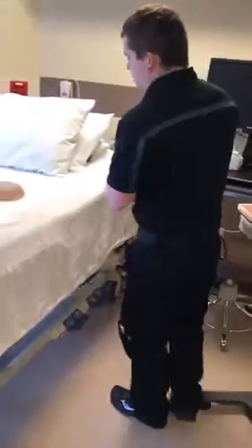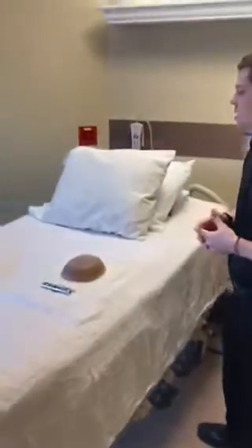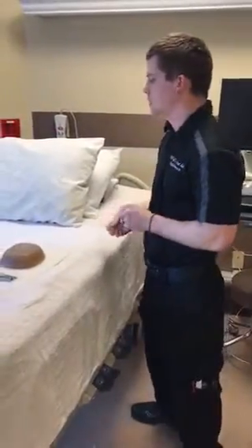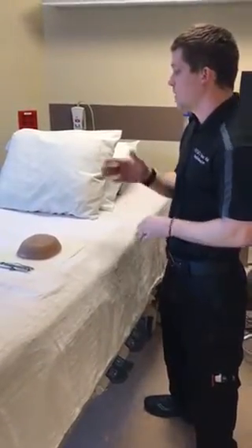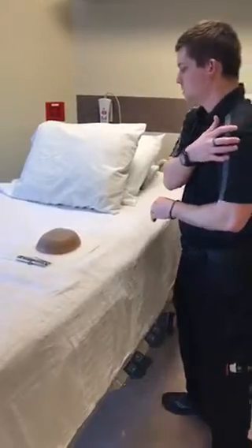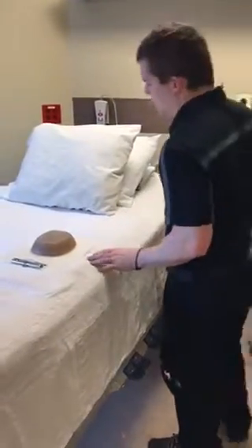Hi, Bob. It's Bobby. I'm your nurse, as you recall from earlier. The doctor ordered a Tdap vaccination for you. That's a tetanus and diphtheria and pertussis vaccination, and we're going to be giving that in your left deltoid, since we're just still picking on the left arm today. I'm going to go ahead and check your allergies. Do you have any allergies?